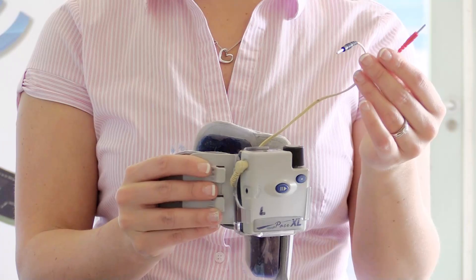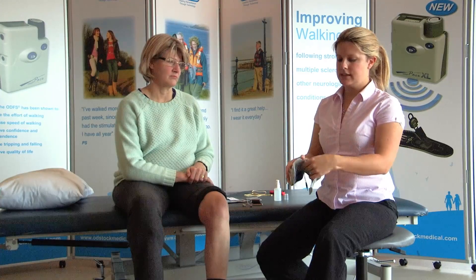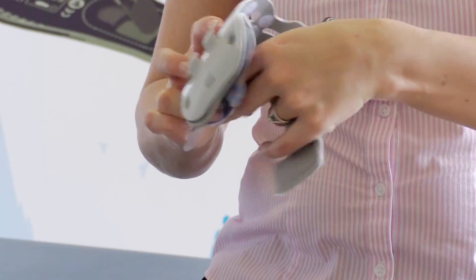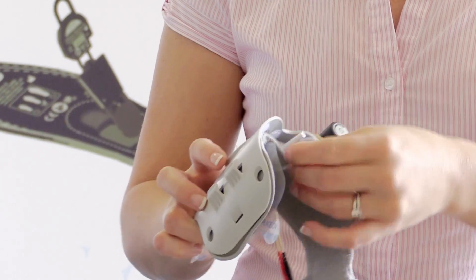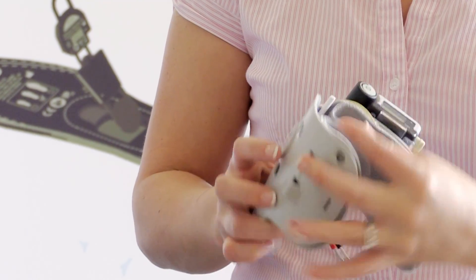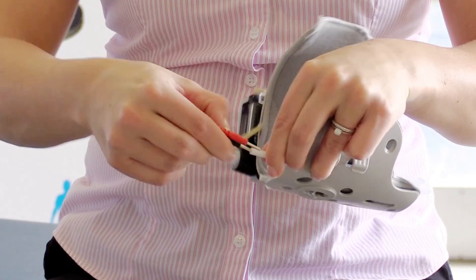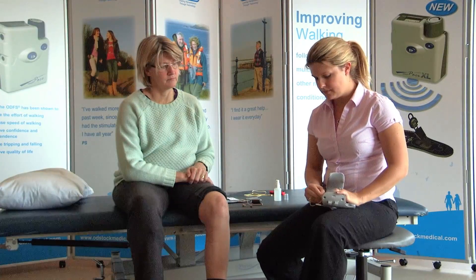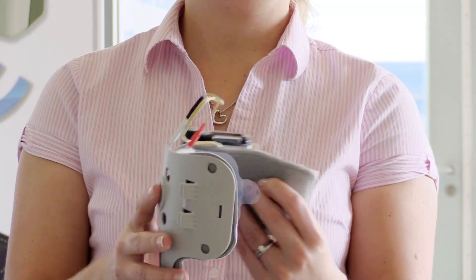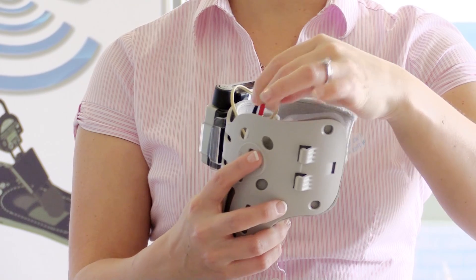Next, connect the electrode lead to the electrodes, checking that you get your red and black the right way around. Gently peel off a bit of the liner to make sure you have both connection points available and connect up as required. To make it neat, tuck the excess lead down, making sure that the pins are vertical.